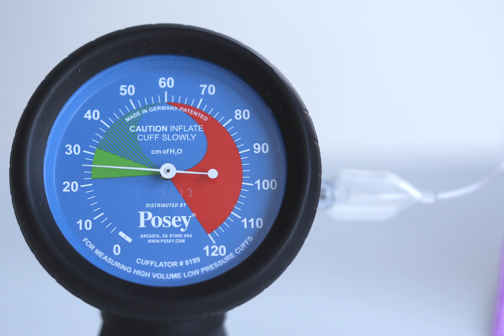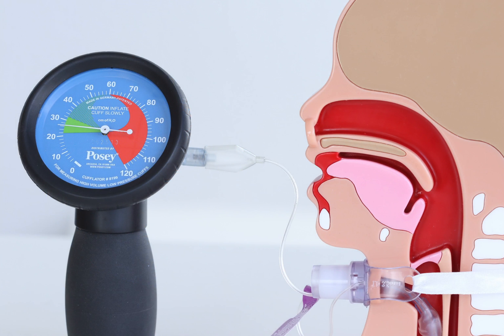Instead, cuff pressure should be measured using a cuff manometer and should be performed regularly and whenever air is added to or taken out of the cuff. A cuff manometer is designed to measure cuff pressure and can be used to inflate the cuff or remove air from the cuff of the tracheostomy tube.